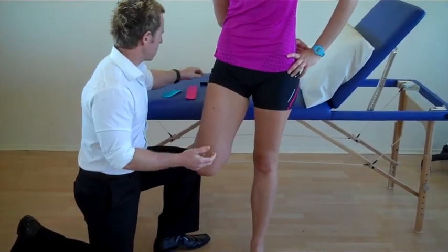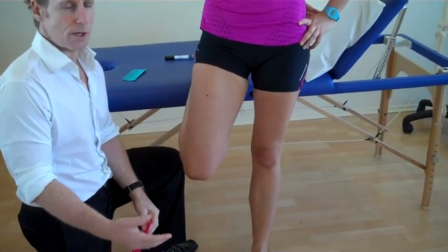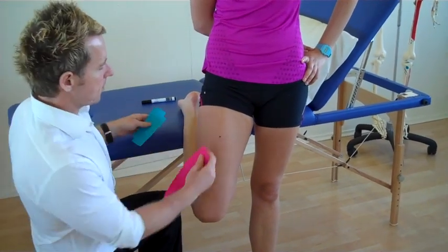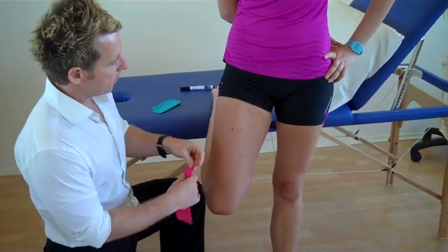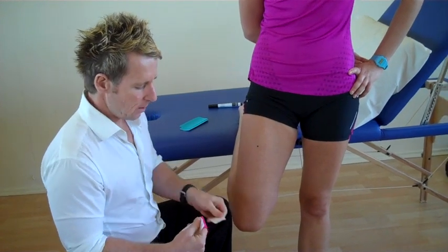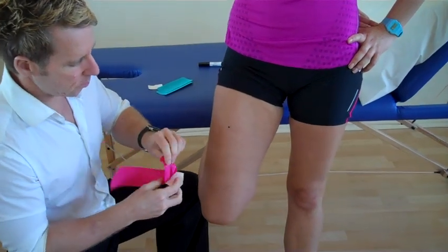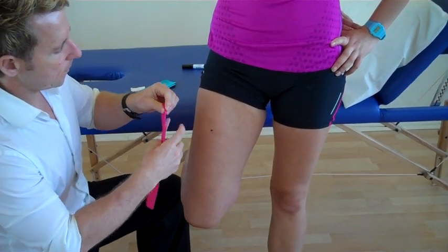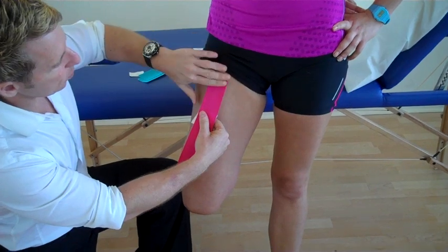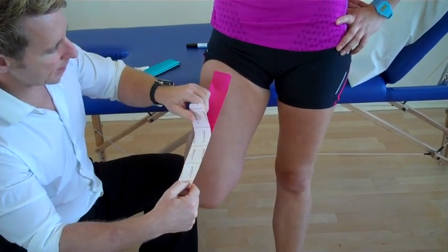So the person has the leg on stretch, which means the rectus femoris is on stretch before we start. We're going to use one piece of I-strip and then two smaller I-strips using the functional tape. So no stretch at the beginning — we're going to split the tape and apply that above where the pain is located. You can literally apply that, go a little bit higher towards the origin, and there's no stretch on the beginning or the end.